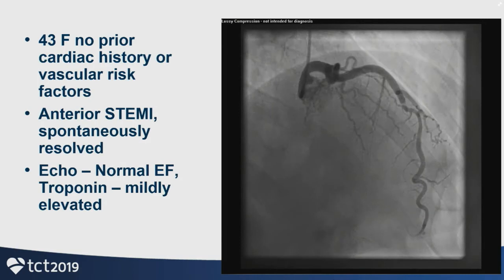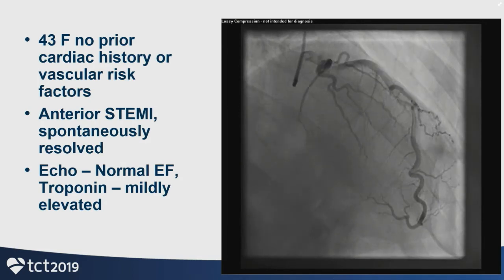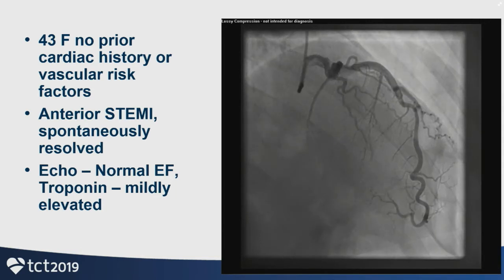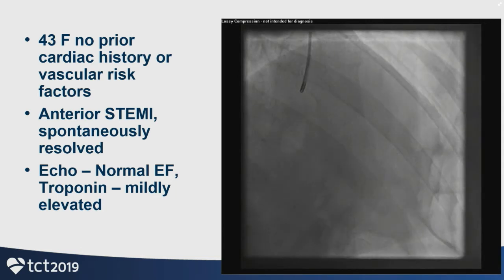This patient is a 43-year-old lady with no previous cardiac history or vascular risk factors, comes to the cath lab with anterior STEMI that is resolved spontaneously prior to the angiogram.